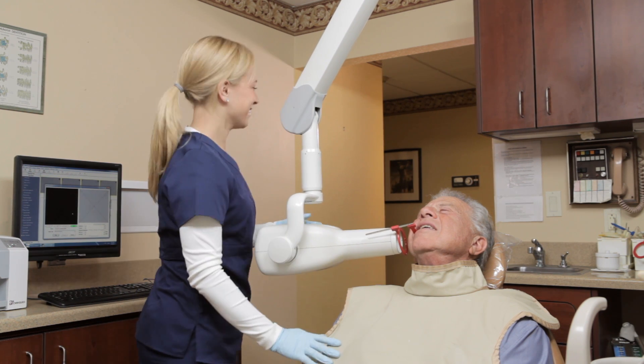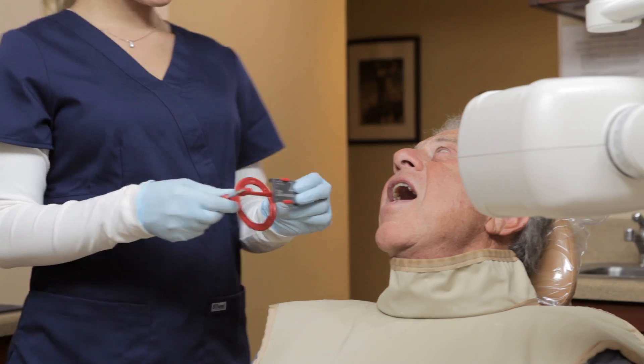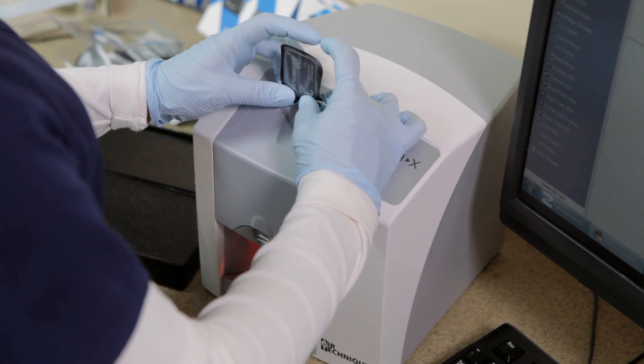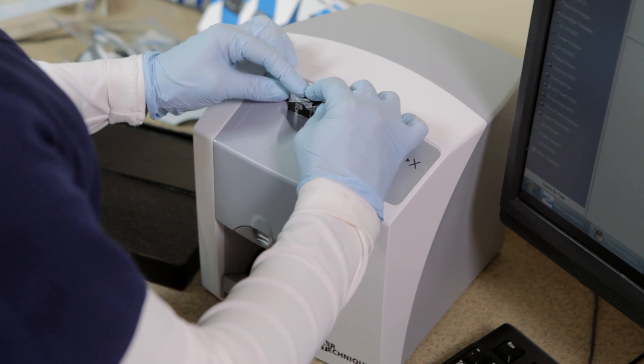Then leave briefly to go to the X-ray machine to capture the image. Remove the sensor from the patient's mouth. Hold the sensor above the inlet guide with the printed side facing you and the notch of the envelope on the bottom.